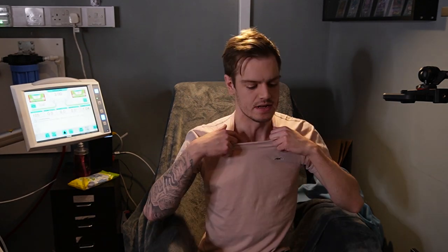Right, so we're almost at attaching now. This is the part where I need to access my line. So if you're a bit squeamish, I'll set a timer to the bit where we're attached, because this bit is going to show the line on my chest. So if you're not squeamish, then feel free to watch on — if you are, just a quick warning now.